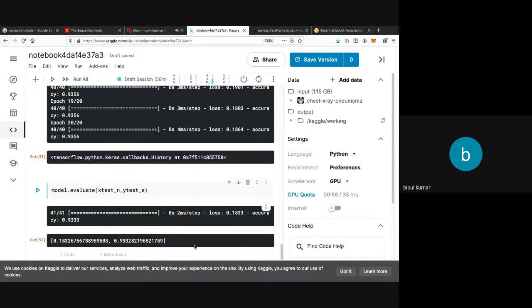So fine tuning, or you can say model tuning, depends upon so many things. While we start building a model, first we check the training accuracy. But it is not just training accuracy that matters; testing accuracy also needs to be checked. When I created this model, the training accuracy was 94%, but testing accuracy was only 77%.